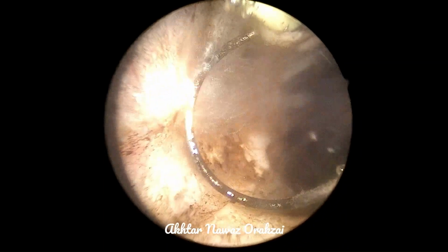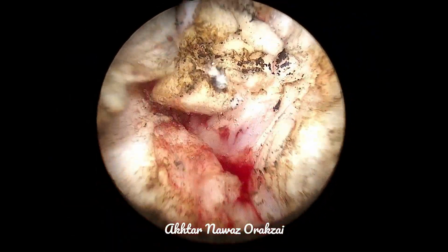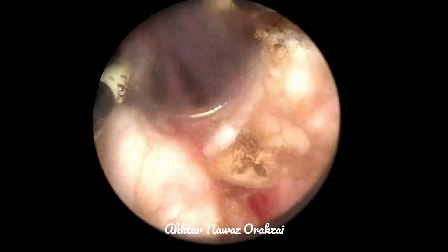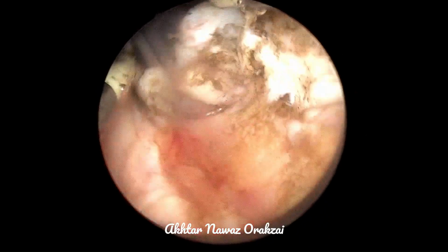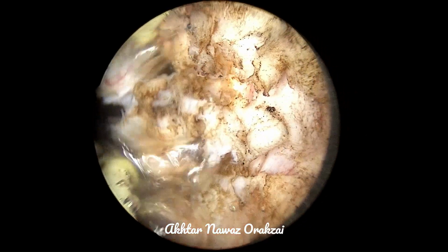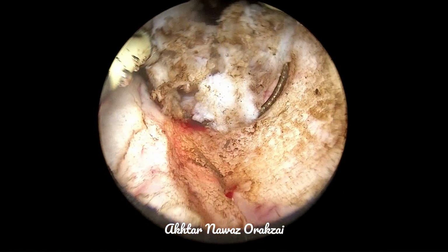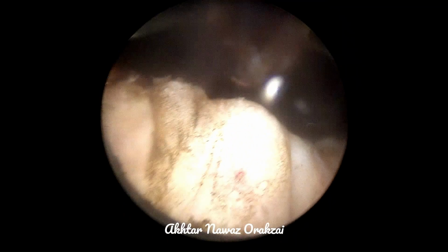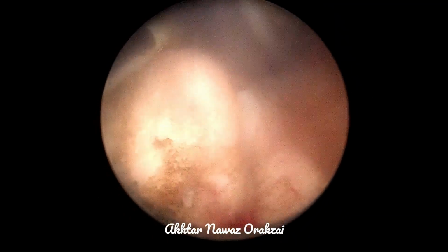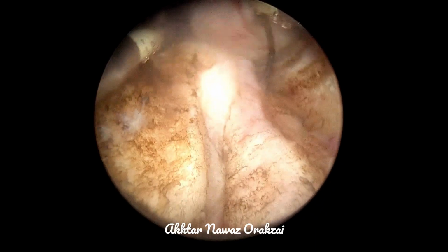And number three, we have seen clinically that patients in whom the prostate is resected up to the level of the capsule have more burning micturition and irritative LUTS for a longer period of time, as against those patients in whom the capsule is not exposed.